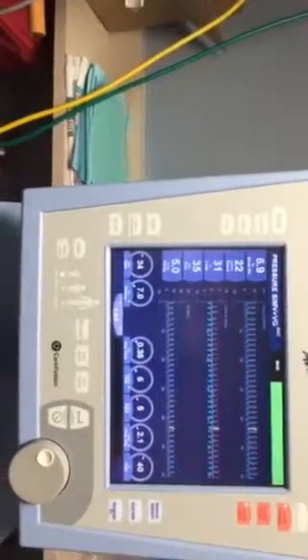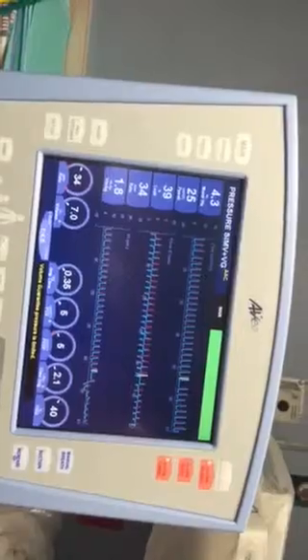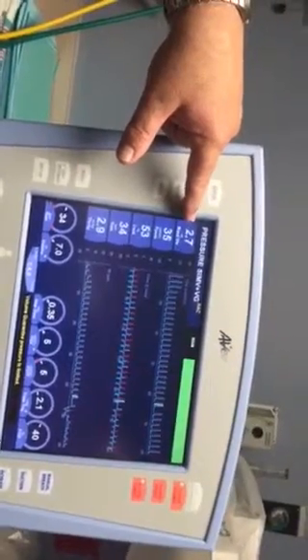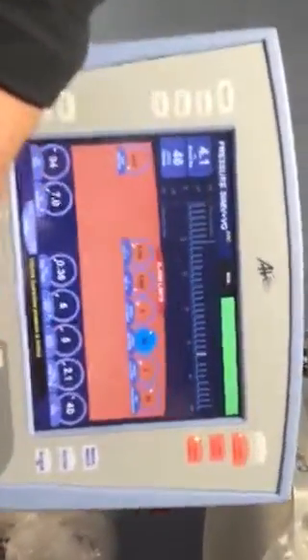So, let's clamp my baby's lungs down, okay? So my volume's going to go down. So see my volume's going down? All right? Watch my pressure. Okay? Watch my pressure. It's now going to go up and up and up until I reach 7 cc's. Okay? It will stop when it reaches my high peak pressure alarm minus 3 centimeters.